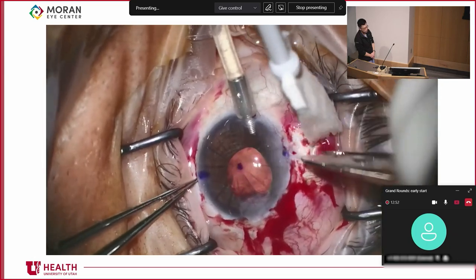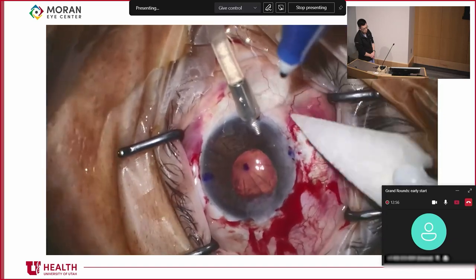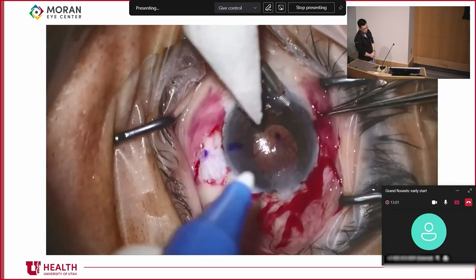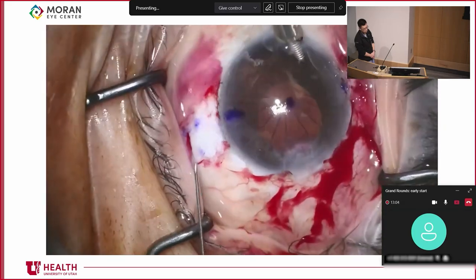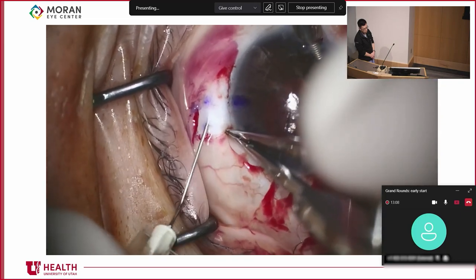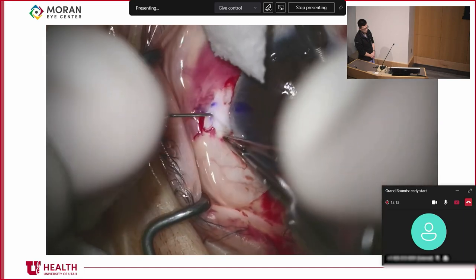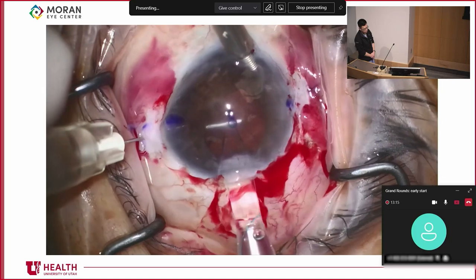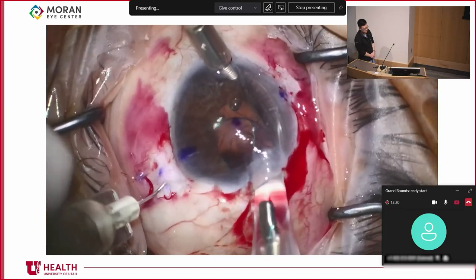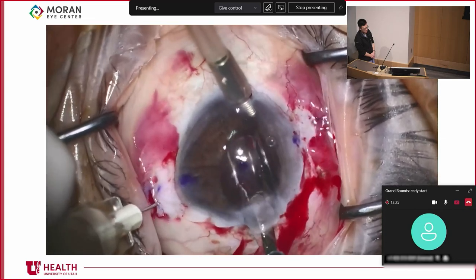So what technique are we going to use? Well, the Yamane scleral fixation, of course, because that sort of worked the first time. But the question is, what kind of lens are we going to use? This whole thing happened because there was a twisting of the haptic at the optic-haptic junction, and this appears to mainly occur with this particular lens, the CT Lucia 602. So in this case, we're going to use a different type of lens, because using that same lens again, I don't think that would be very smart.